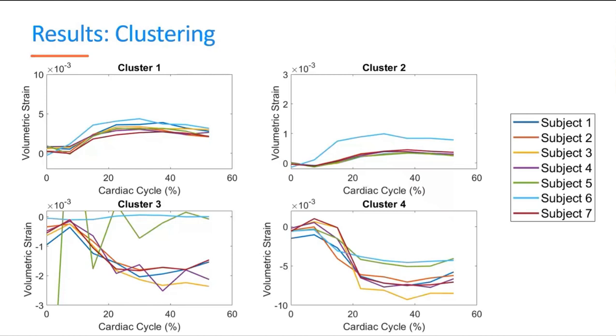In cluster 3, there are differences, with the range more around 0 instead of showing this mild compression. So therefore, for averaging the size of the clusters, we looked at the 5 subjects that showed similar behavior.